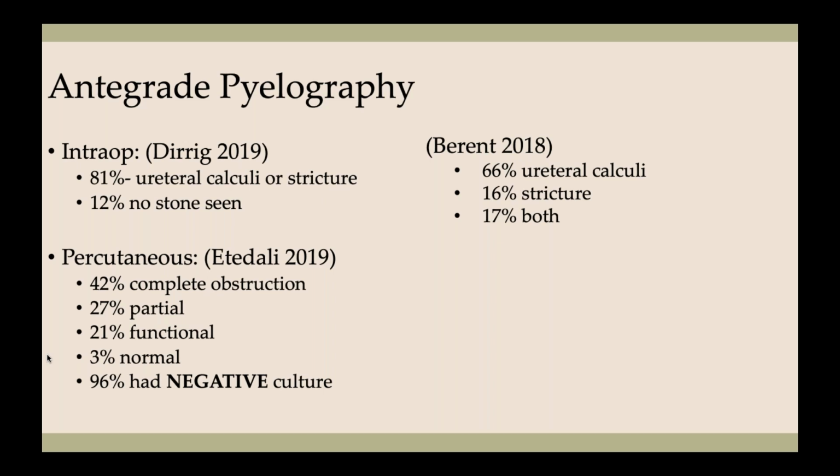have been. Some of those patients did go and have subs placed and have improvement in their azotemia, but I don't know if that's really well understood, what those patients are having. But that's a category that we kind of came up with as we were evaluating all of those studies that we had done.